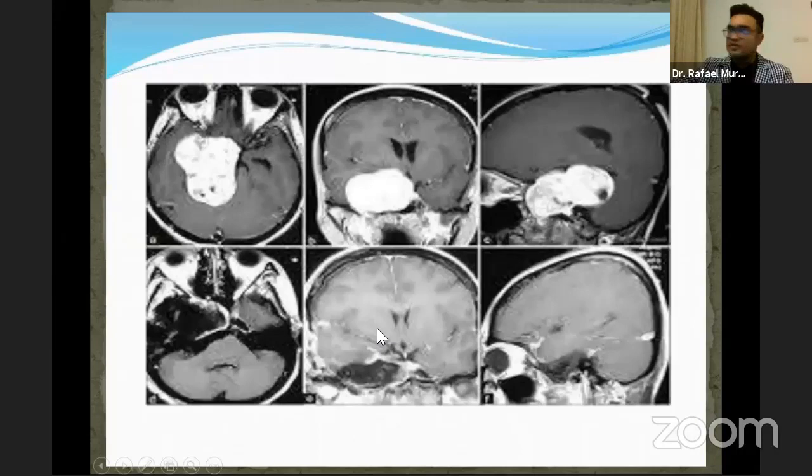And there is no calcification. In case of FLAIR, the signal suppression occurs. So another case, this is very characteristic of diagnostic.